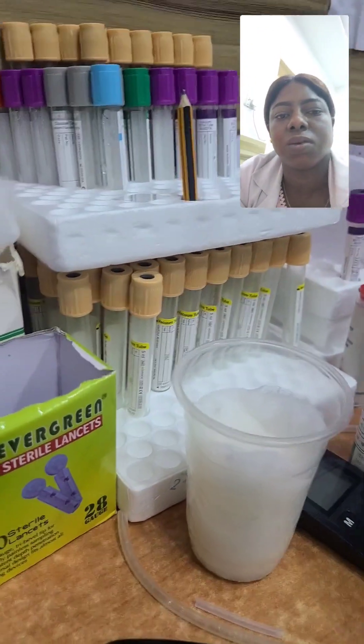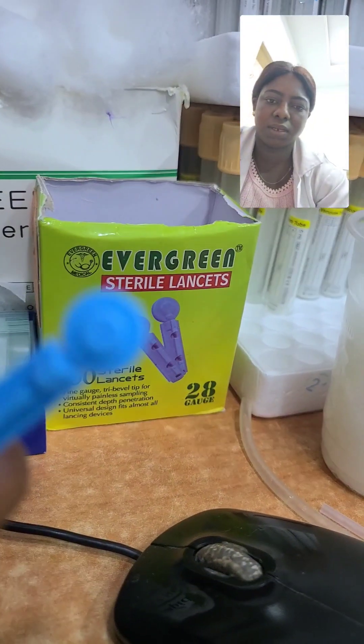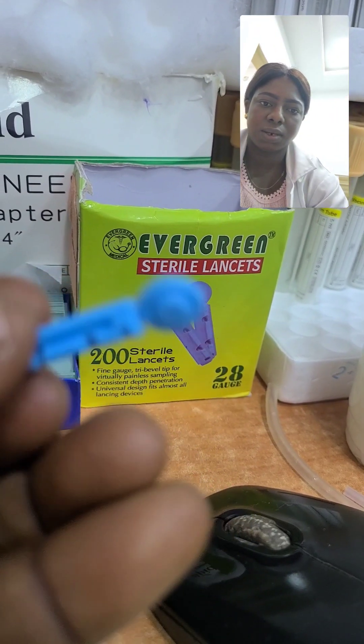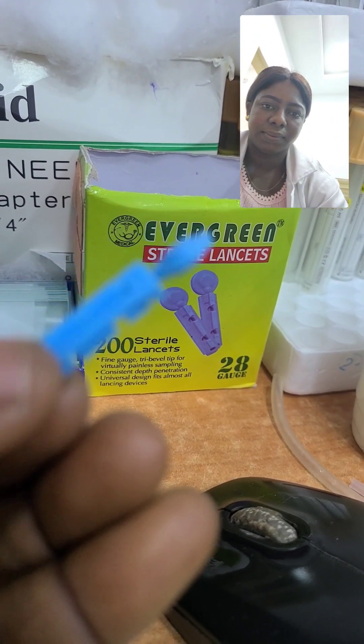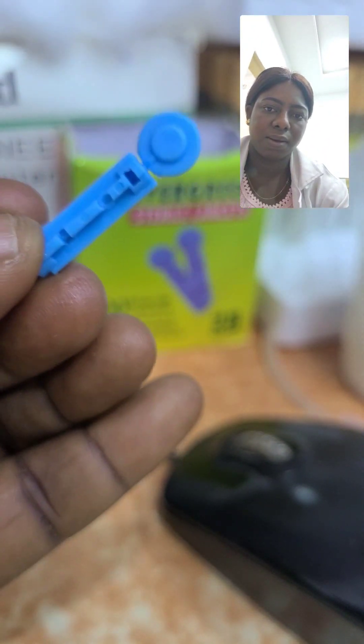This is a sterile lancet. We use it to prick the patient's finger when the patient is doing fasting blood sugar, random blood sugar, or even PCV — before we use the capillary tube to collect the blood.